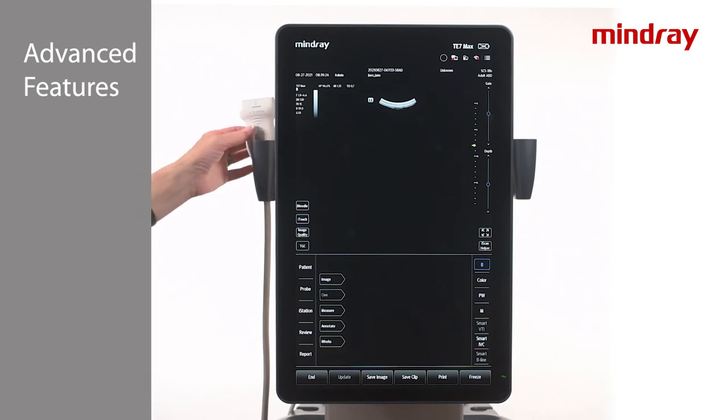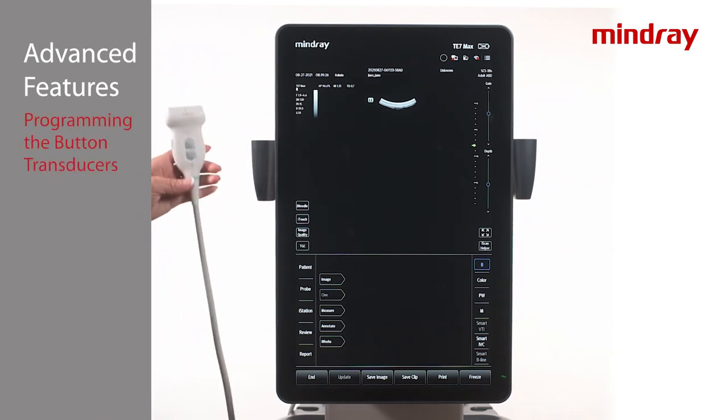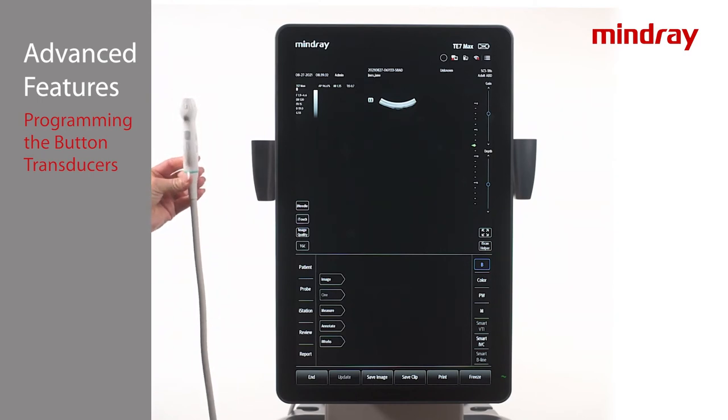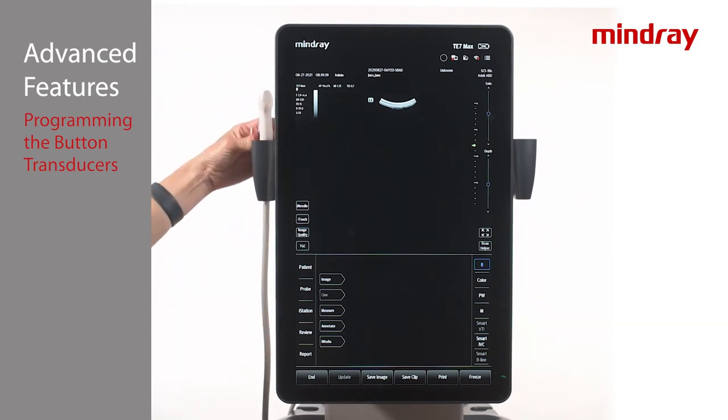The L12-3 RCS and L12-3 VNS linear ultrasound transducers allow operational functions to be programmed onto the buttons. There are three button controls — two on the face and one on the side of the transducer — that can be programmed for multiple functions if desired.